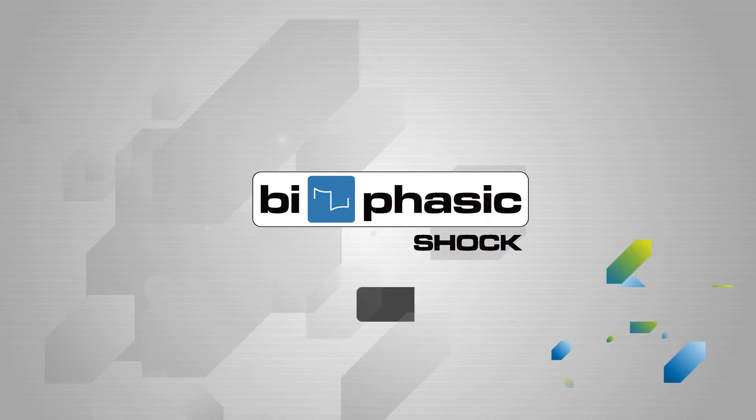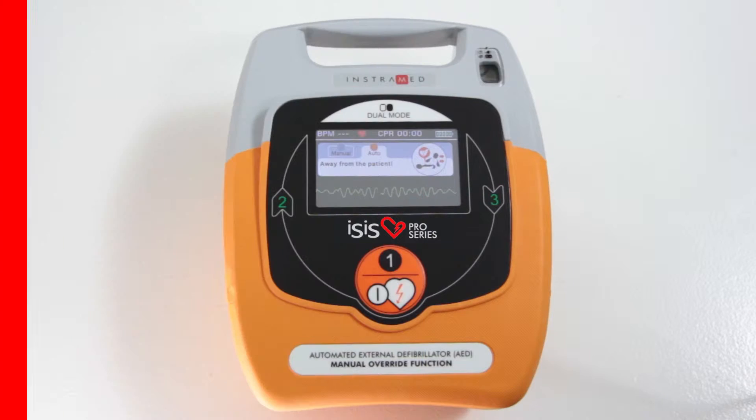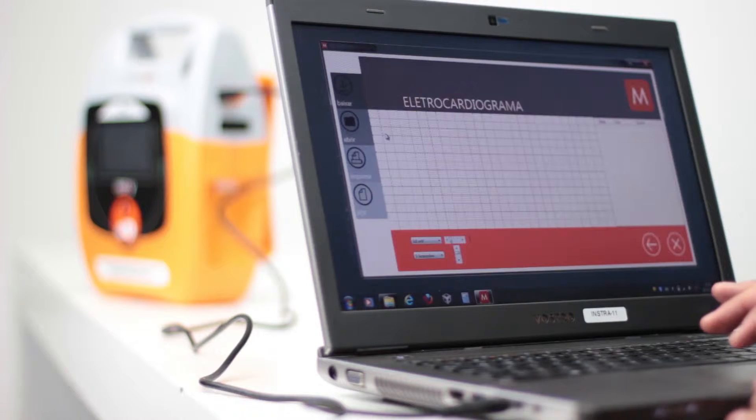Two-phase shock provides greater efficiency of shock treatment. Automatic function and battery diagnostic are included. PC connection allows the device to connect with a PC to visualize events recorded in the internal memory.